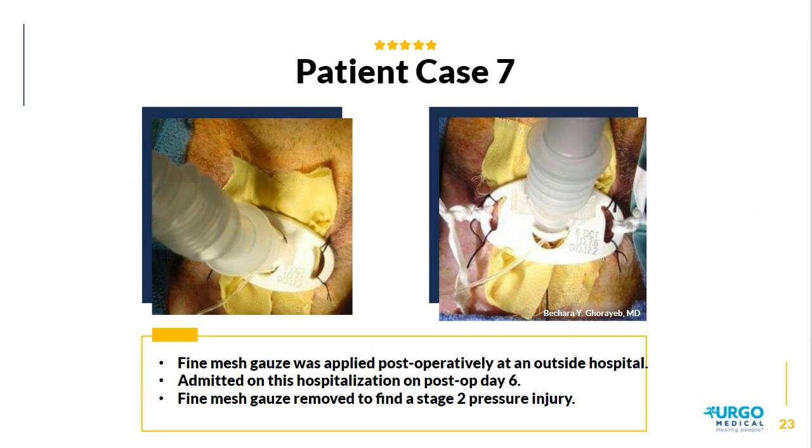Patient 7 had his tracheostomy placed at an outside facility with Zeroform gauze around the tracheostomy site. So that's not typically our practice here. However, he arrived at our facility with the Zeroform still in place, and that was post-op day 6. The tracheostomy sutures were still in place, and so we didn't actually remove the sutures to look underneath.